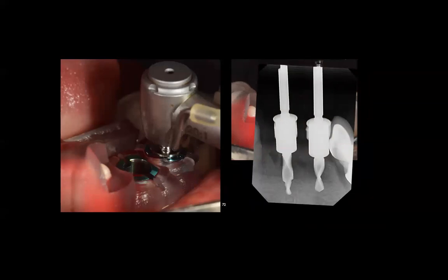Okay, that's the best paralleling pin. The guide is stable, the burrs are inside the bone, they stay there, they don't move. I asked my assistant to take an x-ray, and he did a fantastic job, because it's a little bit hard with all this material sitting above the occlusal plane. Take a look at this image over here. You've got to make sure that you see this bottom out all the way to the bottom.